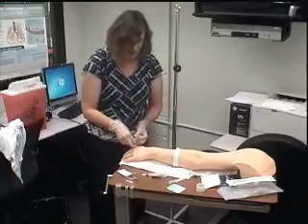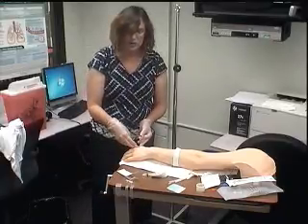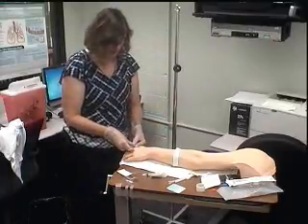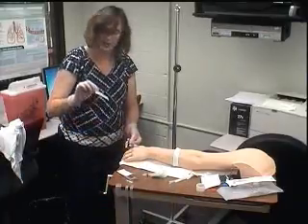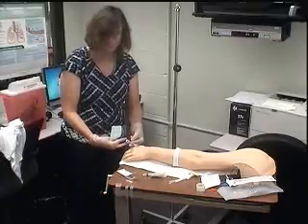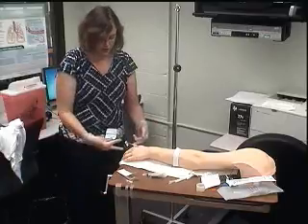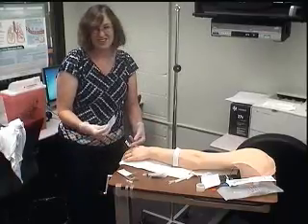Now I've got the catheter on. This is on right here like this, and it's in. So what can I do now? I need to put the dressing on. So I have this dressing. I'm going to take the back of it off. You notice I'm still kind of holding on, because if they move their arm right now, and I just have it flopping, it could actually fall out, and I don't want that, that hurts, to put it in.